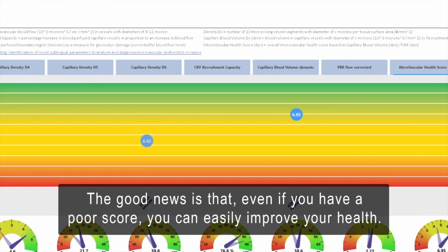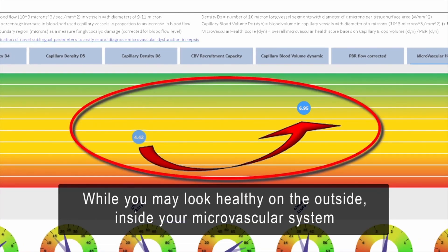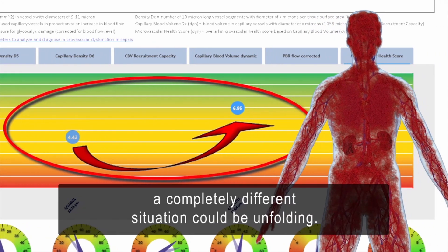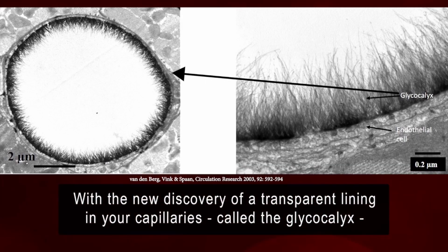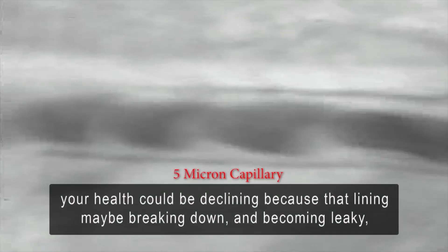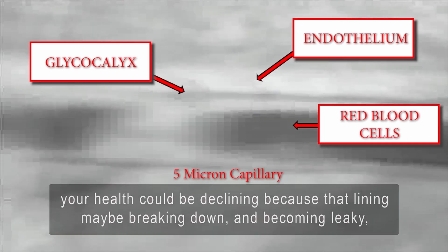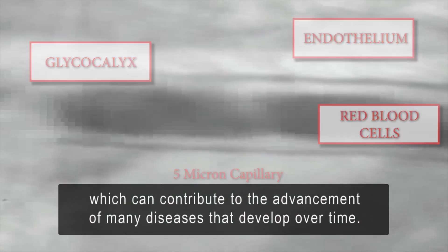The good news is that even if you have a poor score, you can easily improve your health. While you may look healthy on the outside, inside your microvascular system, a completely different situation could be unfolding. With the discovery of a transparent lining in your capillaries called the glycocalyx, your health could be declining because that lining may be breaking down and becoming leaky, which can contribute to the advancement of many diseases that develop over time.